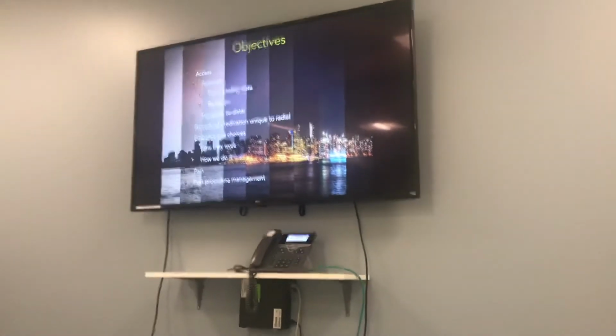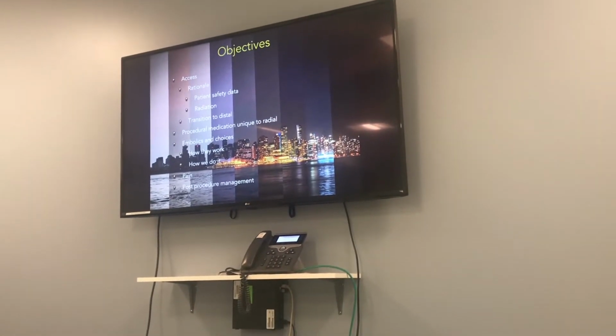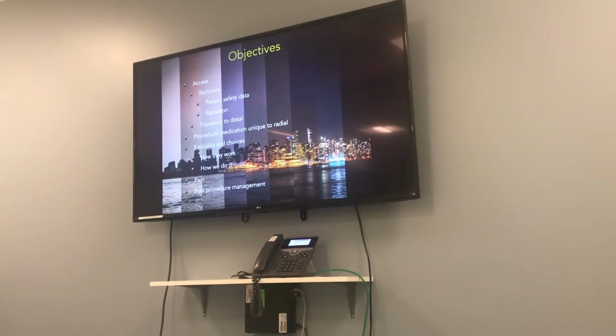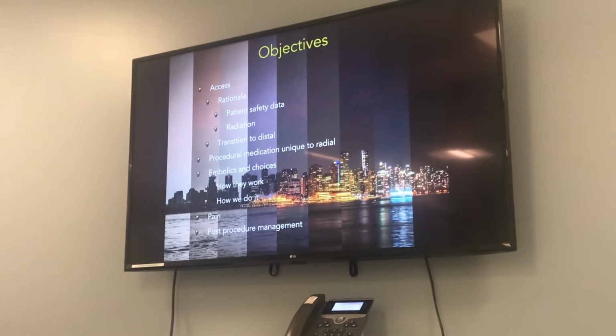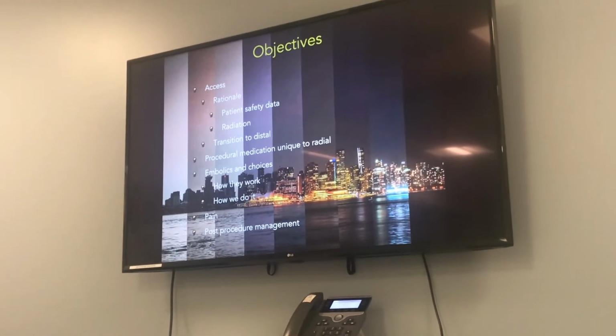Okay. So I'm going to talk a little bit about why we do radial, because that was a huge shift in 2015 from what we did before. I'll talk a little bit about the safety around it, and some of the concerns around radiation dose to the patient that were brought up. You'll notice that some of the patients who come up here have access either through their wrist or through their anatomical snuff box, and I'll go through why that is.